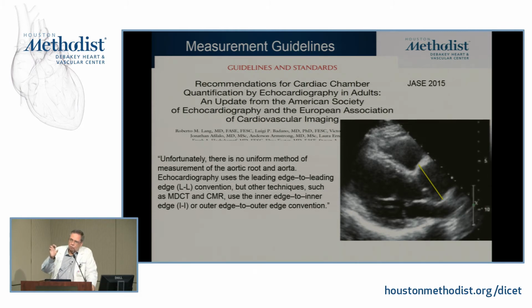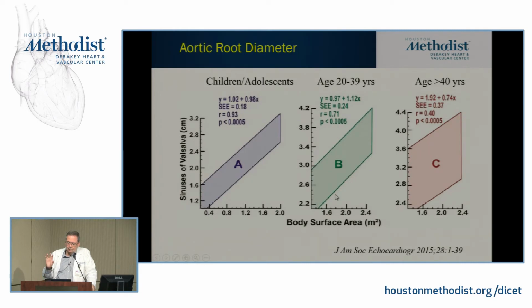Recognizing, though, that normal measurements will be slightly different, because the measurements that we see in all these documents for normality were done with leading edge to leading edge. We just have to accept that that's reality today and do the best to deal with it. It's a 1 millimeter difference, but it still could be important at times.